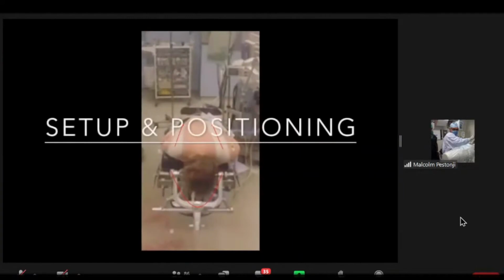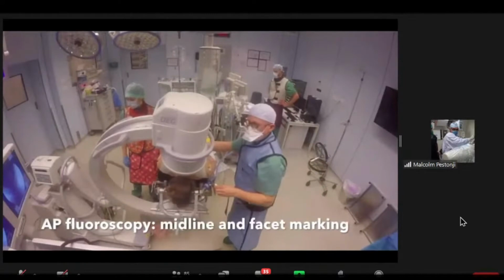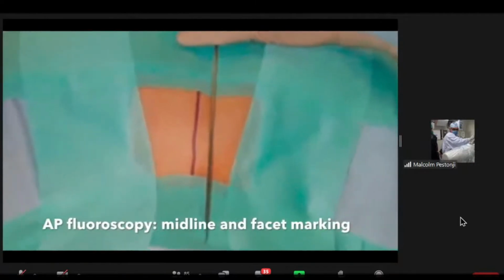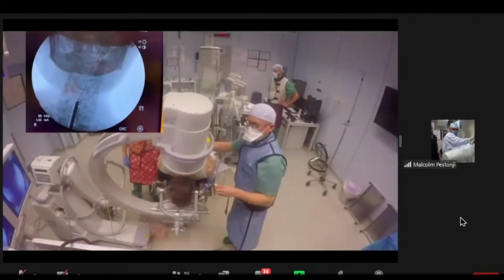The patient's head is fixed in a Mayfield holder. For good imaging in lateral fluoroscopy at the C7-1 level, it's important to put traction on the shoulders. During the endoscopic surgery, fluoroscopy will remain in lateral view. As a reference, in AP fluoroscopy, the midline and facet lines are marked. This lateral line at the middle of the facets will be the entry point for the camera of the endoscope.